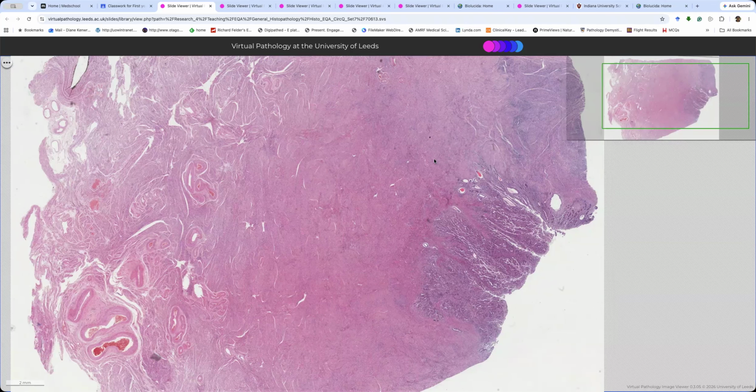These ones you have to look really carefully for lymphovascular space invasion because they are more likely to have it. Serous carcinoma. Are we all good?